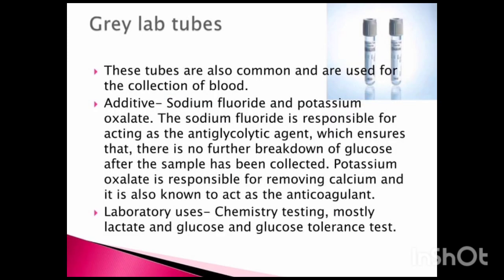You may also find these pink tubes. These pink tubes basically are the purple ones. These also contain the anticoagulant EDTA and can be used for cross match and other blood samples such as the Coombs test also.